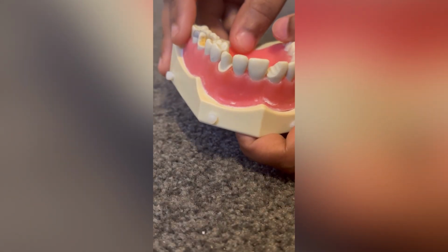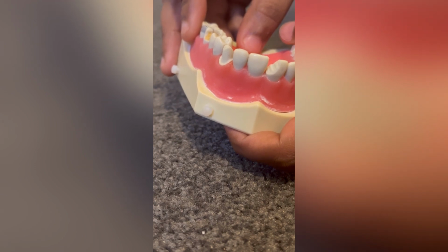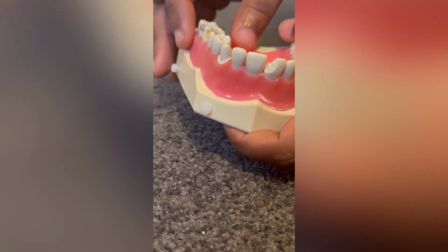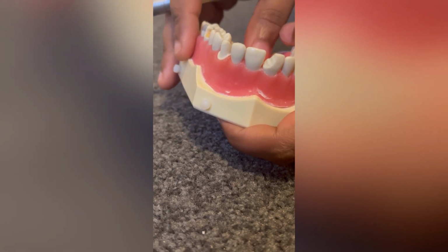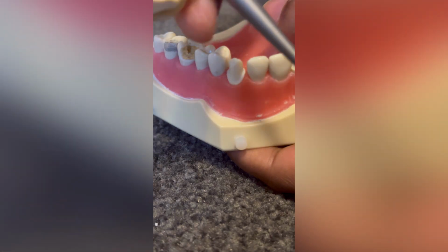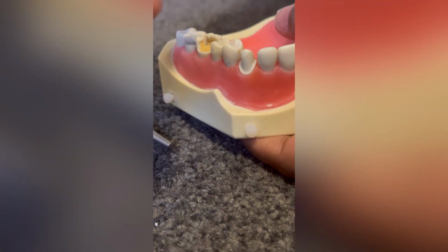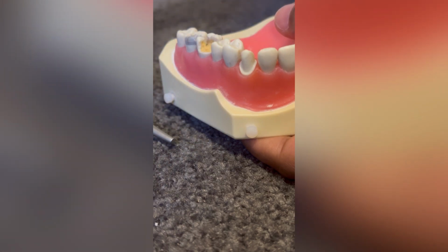So today we will be assessing one of the most important technical tasks provided in the Australian Dental Council examinations. We will assess this task with our criteria provided by the ADC. Now I've got a putty here, but it's not an ideal one. I've used an old one just for the measurements here, but usually we recommend taking at least three putties for accurate measurements.